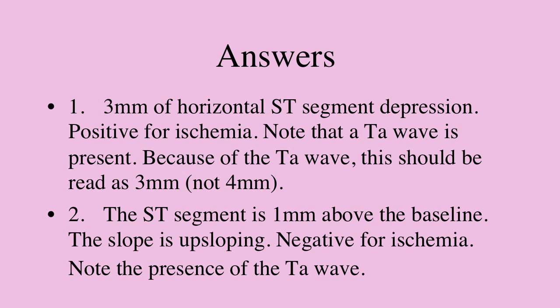And on page 78, there's an example where this person that I was testing had chest discomfort during the GXT, and we looked for ST segment depression and saw none, which is usually inconsistent with what should happen. But we did see that the QT interval was not shortening, and you can see it under the chest discomfort. If you measure that QT interval, it's about the same as it was at rest. There's no shortening of the QT interval.